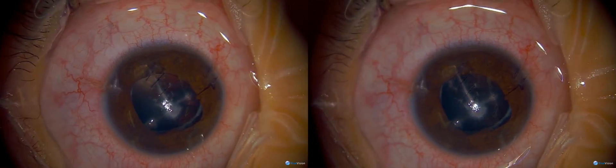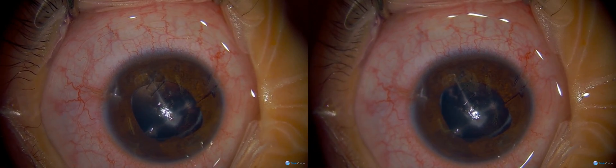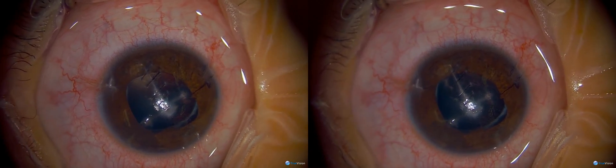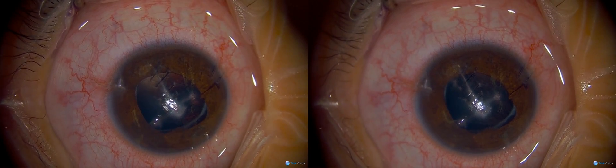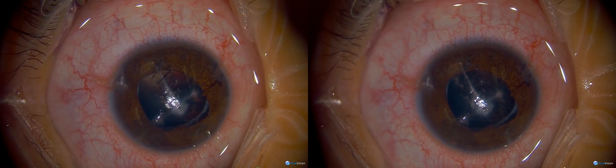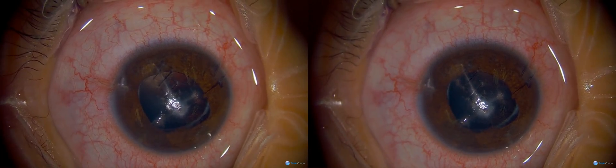This is a five-year-old girl who had a knife to the eye. The primary repair was just repair for the ruptured globe, followed by hydration of the cataract, and she underwent a cataract extraction lensectomy about five days later. Normally we wait about a month in children, then remove the stitches. In a primary repair of a ruptured globe, we don't put in a lens at that time — we wait until suture removal.